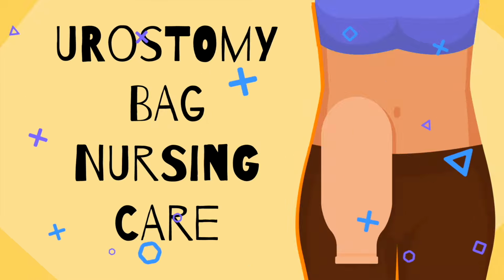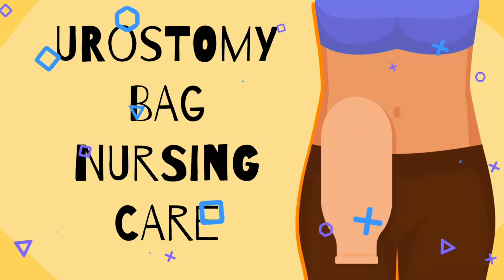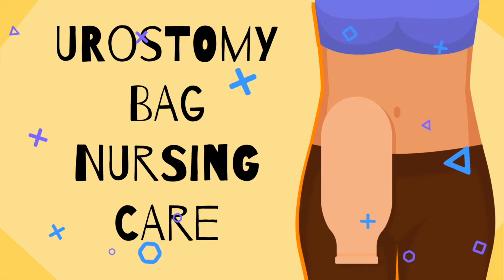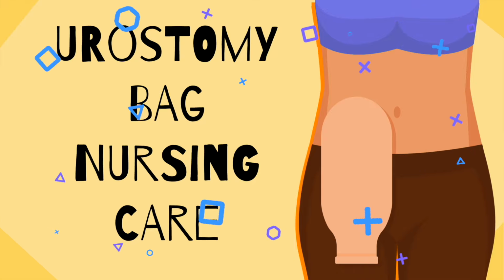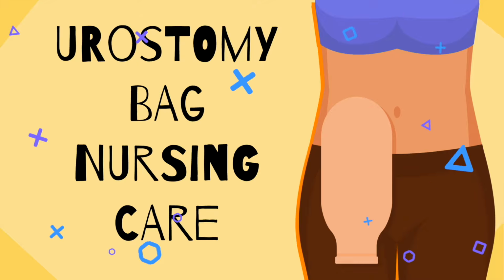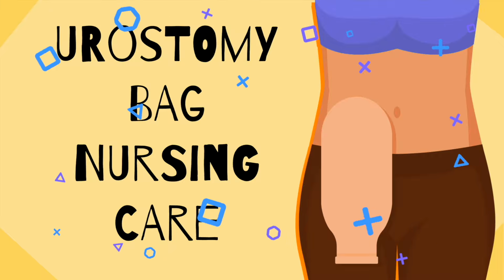With that being said, we're going to talk about the nursing care of a urostomy bag, including the surgical procedure itself, care of the stoma, types of urostomy bags, as well as patient and family teaching and more. So let's jump right in.